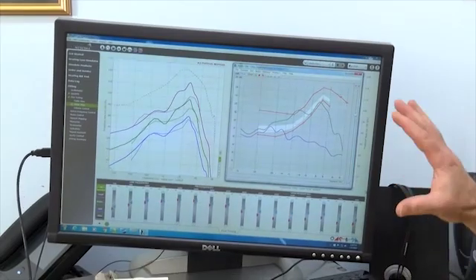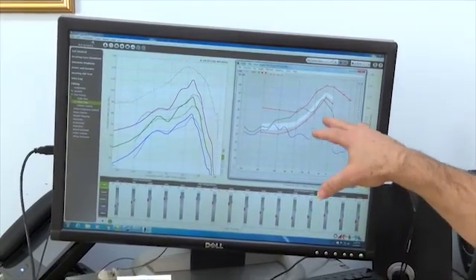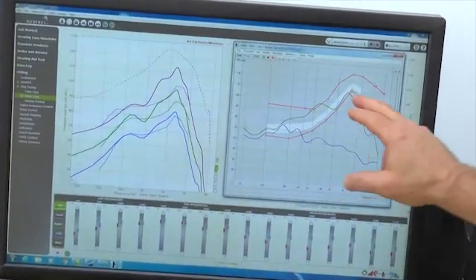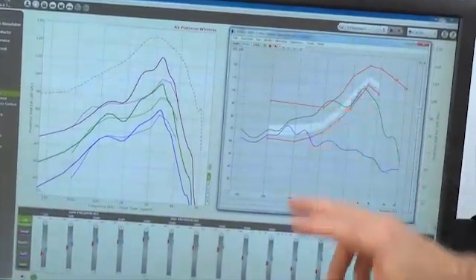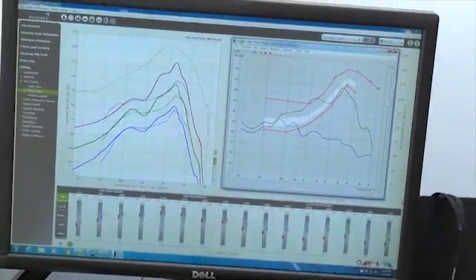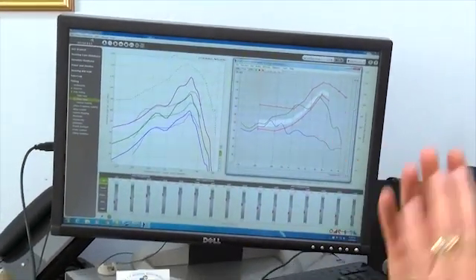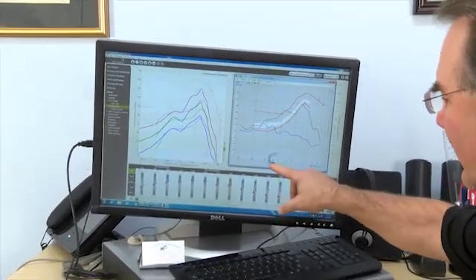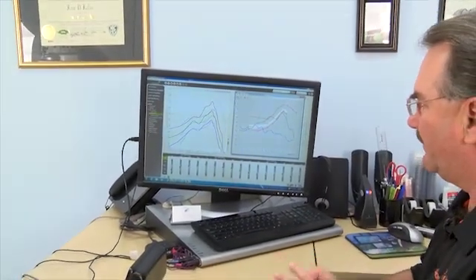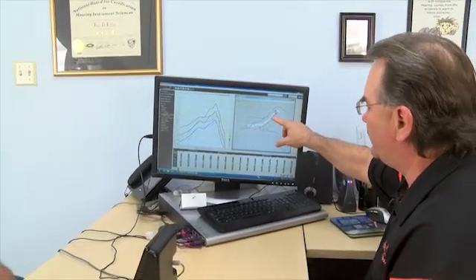Now, if I were programming this for the first time, I would pull this down by using these bars. I would probably try to move this up. But Tim and I have gone back and forth with his programming to fine tune what he's comfortable with. And Tim likes a little bit extra emphasis in these frequencies because it helps with some of his clarity.